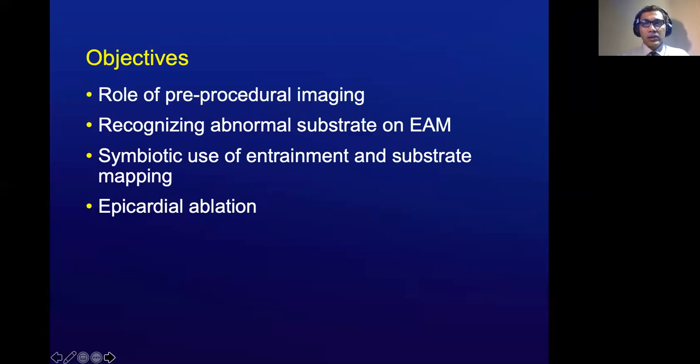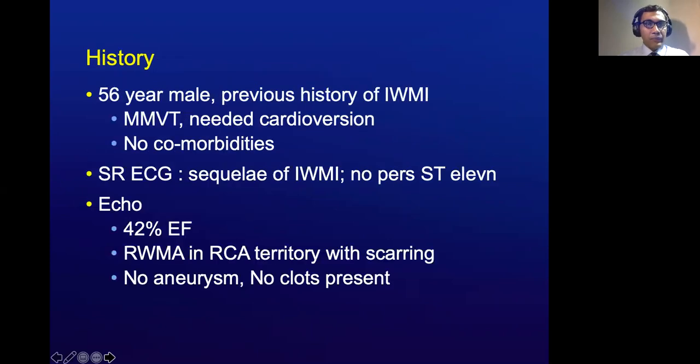The objectives for this particular case presentation are to appreciate the role of pre-procedure imaging, recognize abnormal substrate on electroanatomical mapping, and demonstrate a symbiotic use of entrainment and substrate mapping and ablation within the epicardium.